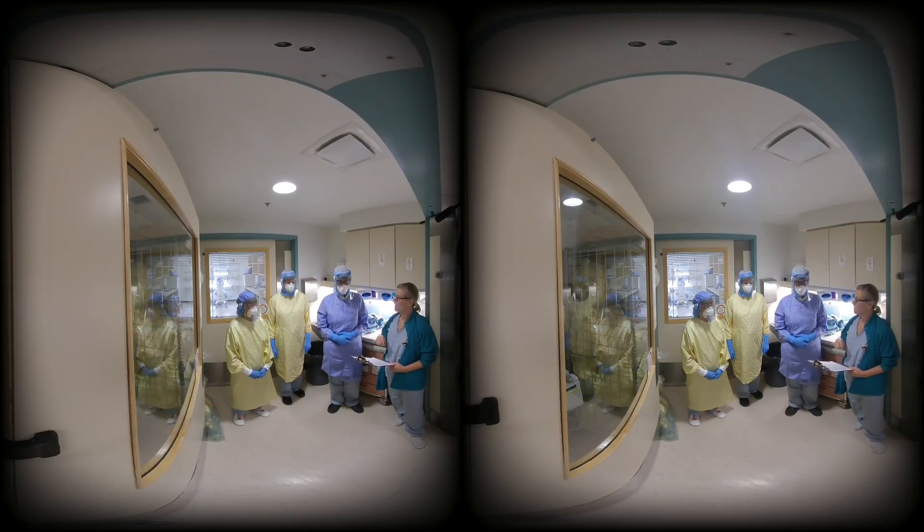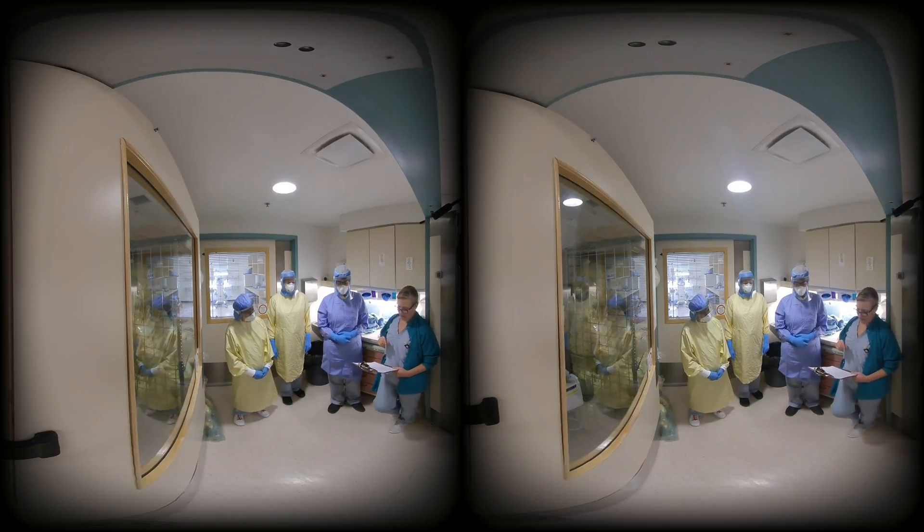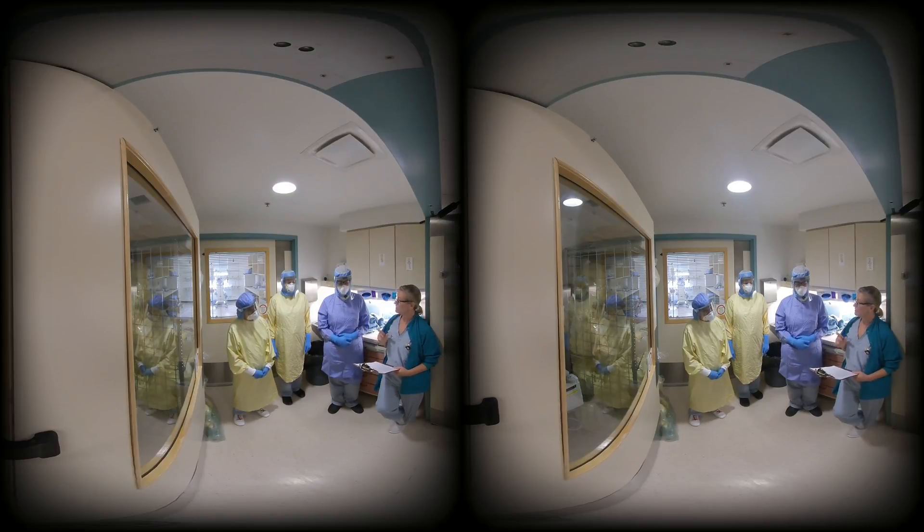If a difficult airway is anticipated, a difficult airway cart or other standby equipment can be brought to the area and brought into the room as needed. Proper application of personal protective equipment should be verified by an independent observer prior to entry into the patient room. The additional use of goggles can be considered, given the potential for expectorated secretions to flow around front-covering face shields. These goggles will need complete disinfection after they are used.